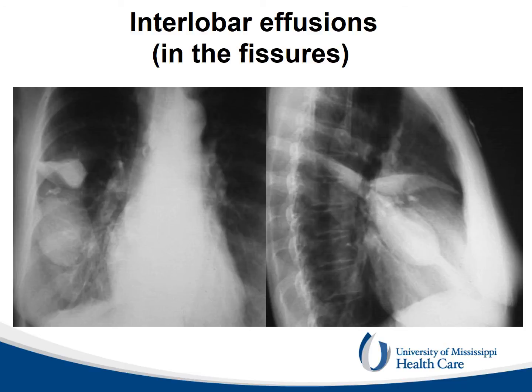Sometimes the effusions develop in the interlobar fissures and don't communicate with the remaining pleural space. Their appearance is characteristic in the lateral chest X-ray projections.